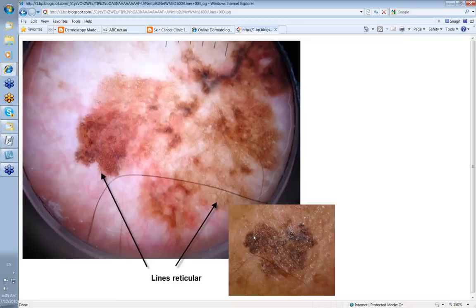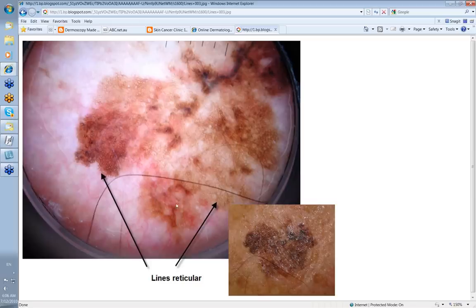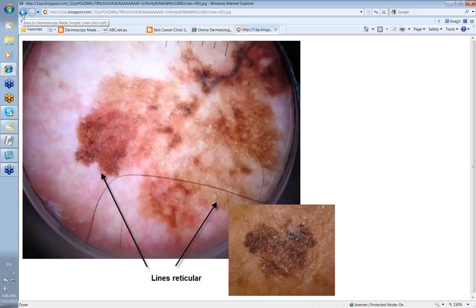This clinically is a variably pigmented lesion, and dermoscopically you can see lines reticular — net-like lines reticular — but there are different colors. These are much darker in this area than here; they're disrupted here, a different shade here again. So these lines reticular are part of a melanoma. This was a superficial spreading melanoma.